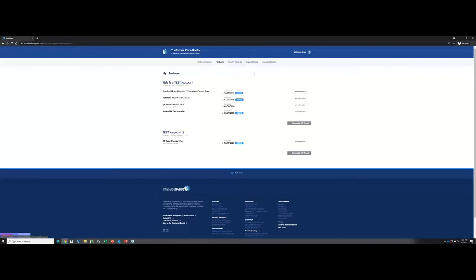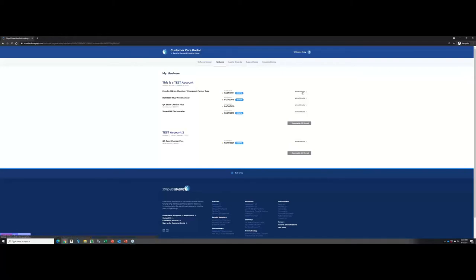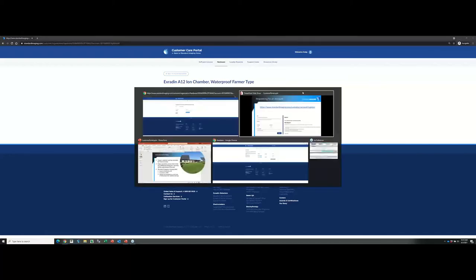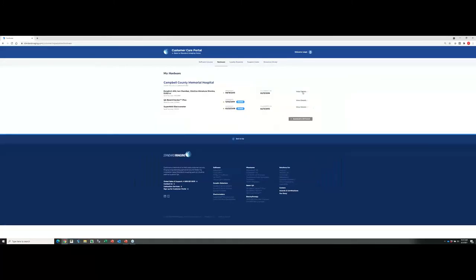One thing that is different here in the hardware tab is this view details option over here on the right. What that is, is it provides you information about your calibration. In our test account, we don't currently have any calibrations. So I've actually contacted one of our partners, Campbell County Memorial Hospital. I'll shout out to them. They're located up in Gillette, Wyoming. They've actually given me permission to log into their account. So that's what I'm going to do here now.